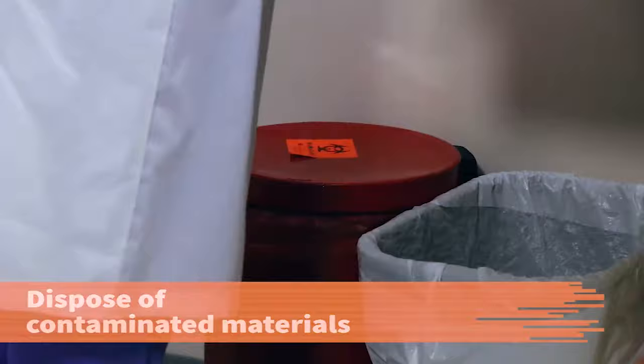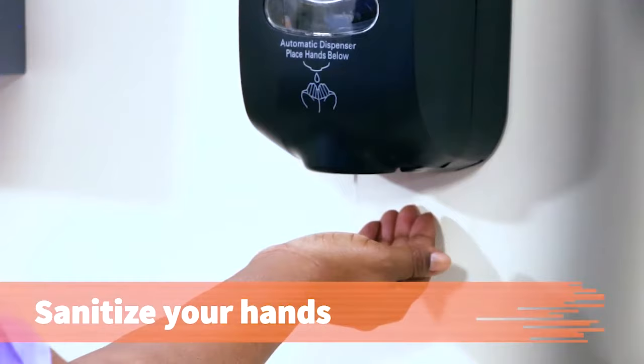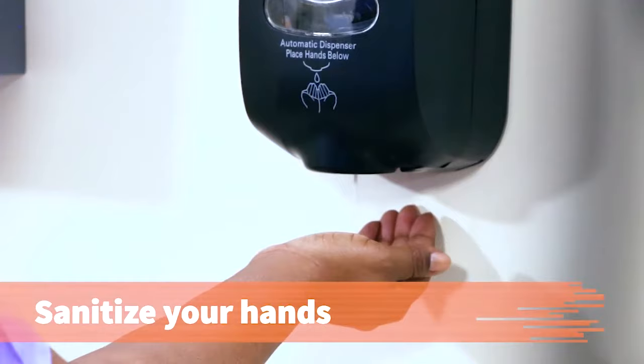Dispose of blood-contaminated materials in the biohazard waste container. Disinfect the work area. Remove and dispose of your gloves, then remove your protective eyewear. Sanitize your hands. Complete the laboratory requisition form and route the specimen to the proper place. Document the procedure in the patient's record.